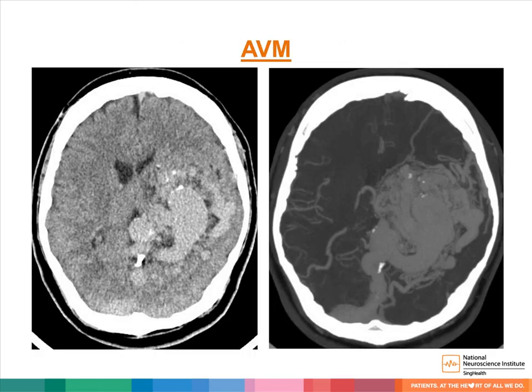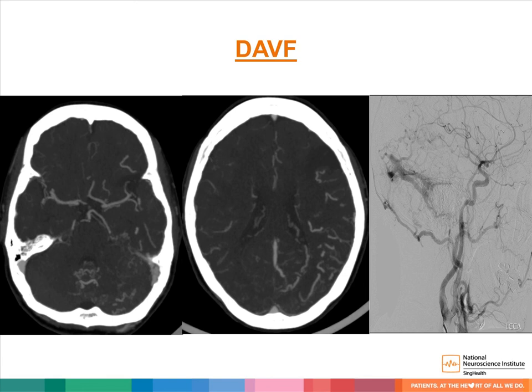Clinical features of stroke can be due to other underlying causes that can be a contraindication to the administration of IV thrombolysis. In this example, we show a large arteriovenous malformation in the left cerebral hemisphere. In this patient presenting as an acute ischemic stroke, CT angiogram of the Circle of Willis demonstrates features suspicious for an underlying dural arteriovenous fistula. Subsequent angiography confirms the presence of an underlying dural arteriovenous fistula. Administration of IV thrombolysis in such patients can result in severe intracranial hemorrhage.